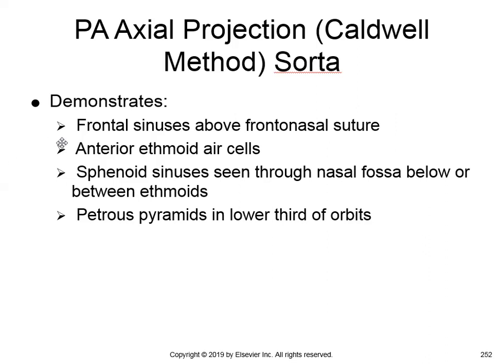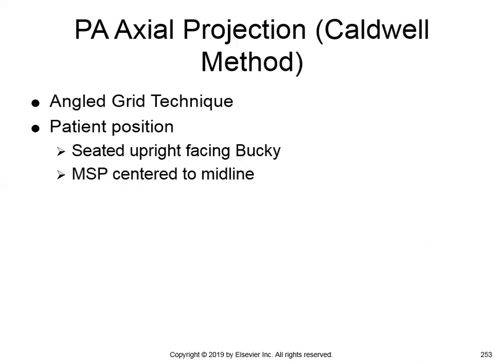So it's sort of a Caldwell. It's not really a Caldwell. Again, your Caldwell is PA projection with caudal angulation, but we're going to angle the head instead of angling the central ray. So there's a couple of different ways to accomplish that, and if you look on page 100 of your textbook, you'll see what it is.